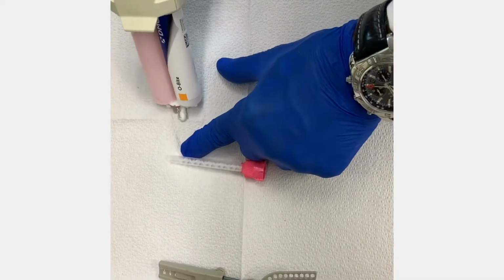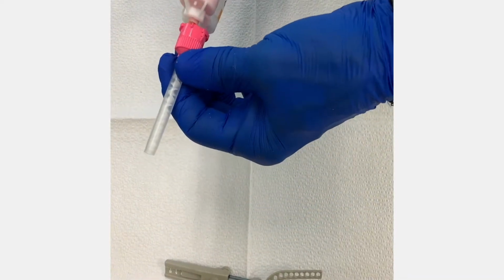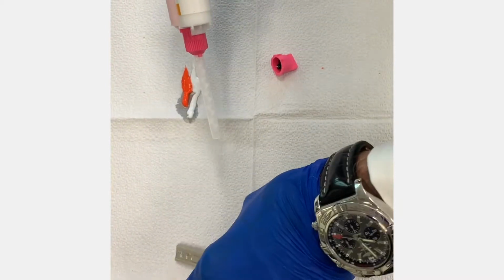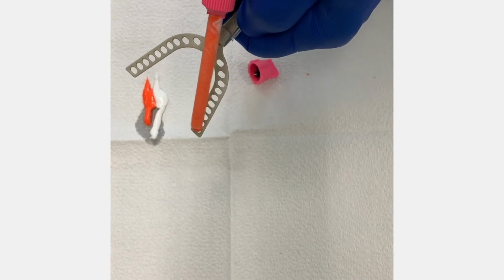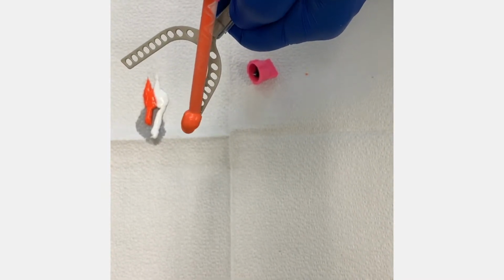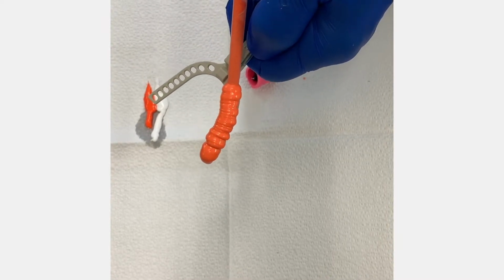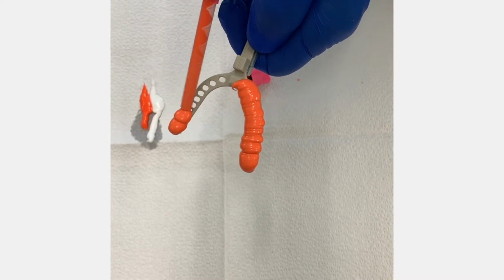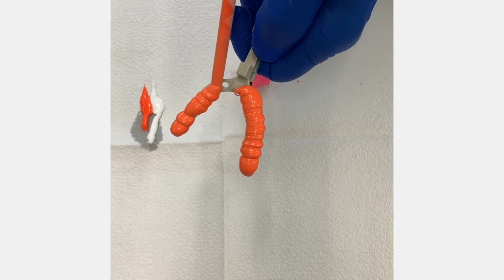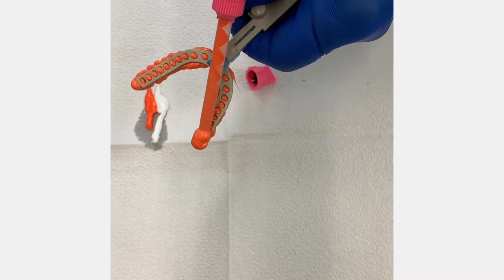Impression material, wax, or bite registration can be used for this. I will be using O-Bite bite registration from DMG. Always bleed the tip before applying. This material is perfect for this situation due to its minimal bite resistance, which allows a patient to completely close into the George Gage bite. When applying to the bite fork, you will notice great stability and staying in place on the fork, which allows me to slowly extrude the material without developing any type of air pockets. It also has superior break resistance, which is necessary for the lab to accurately mount the models.